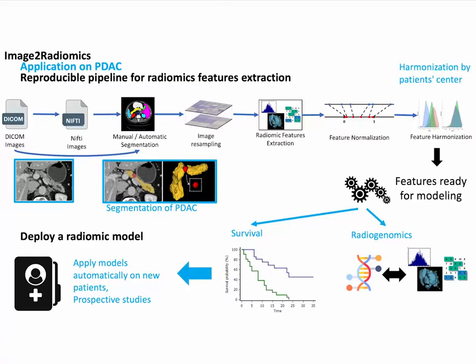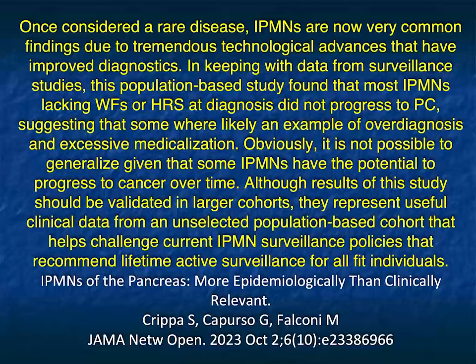And we think about how we want to do things as basically a pipeline for radiomics feature extraction. This pipeline will not work unless you can isolate the pancreatic gland accurately. You can't cut off any of the pancreas, and you can't take additional material from stomach, from spleen, from duodenum or aorta, or anything else. So again, we need to put all of this together, and we're working on it.